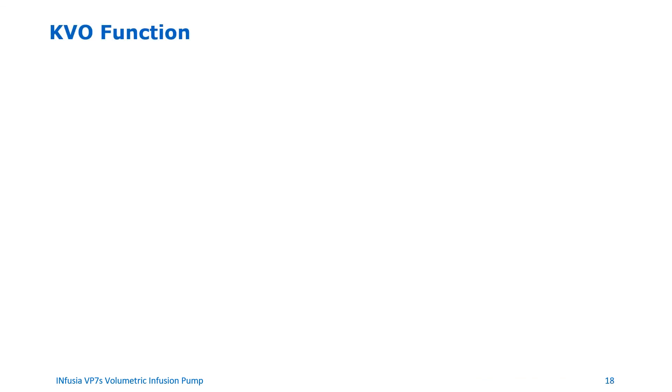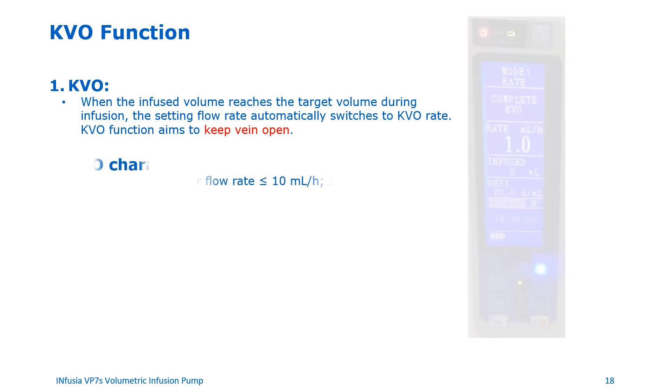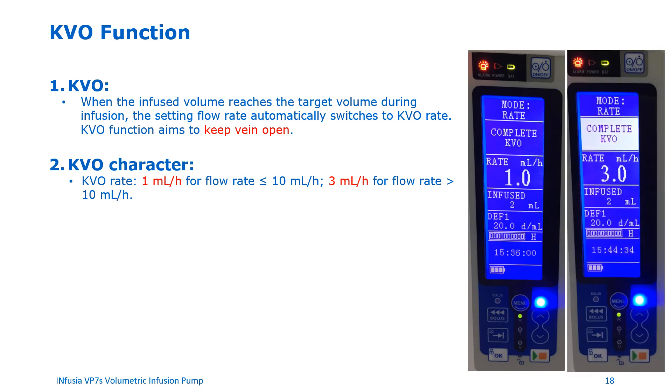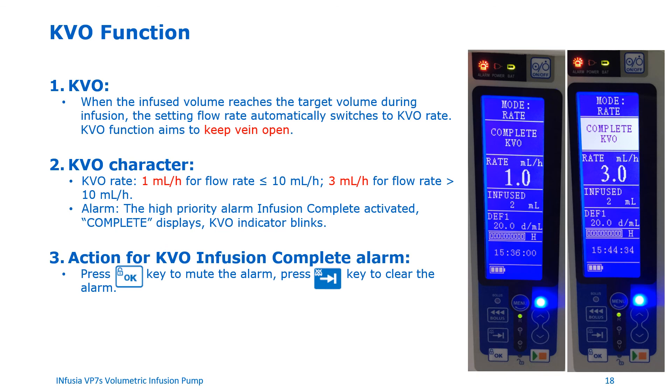Keep vein open function. The KVO function aims to keep the vein open. When the infused volume reaches the target volume during infusion, the set flow rate automatically switches to KVO rate — 1 mL per hour for flow rates less than or equal to 10 mL per hour, and 3 mL per hour for flow rates greater than 10 mL per hour. When the target volume is reached, the pump displays 'complete' on the screen and the KVO indicator light starts blinking. To clear the alarm when KVO infusion is complete, press the OK button to mute the alarm and the switch button to clear it.